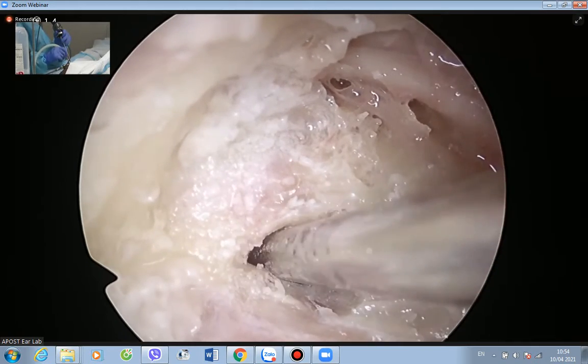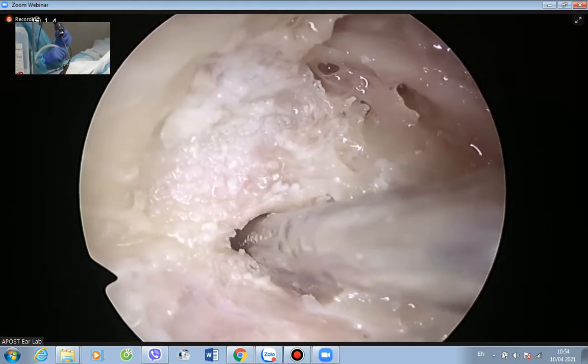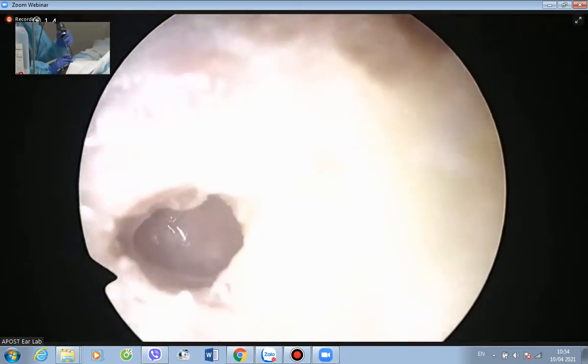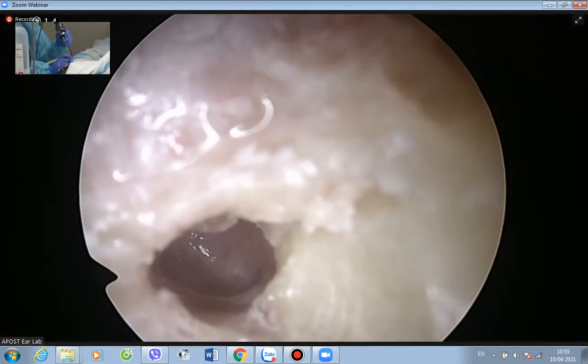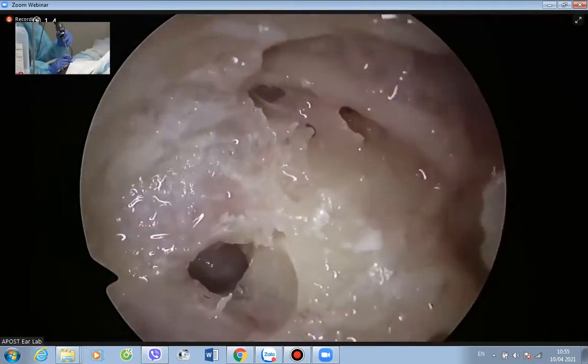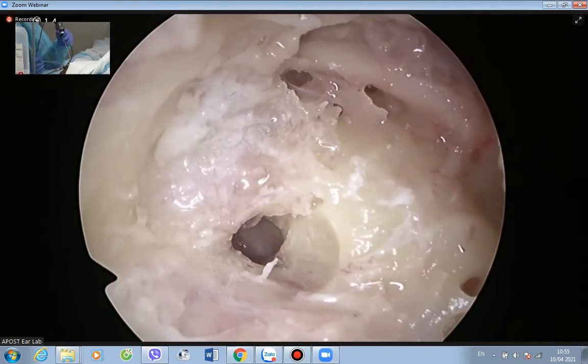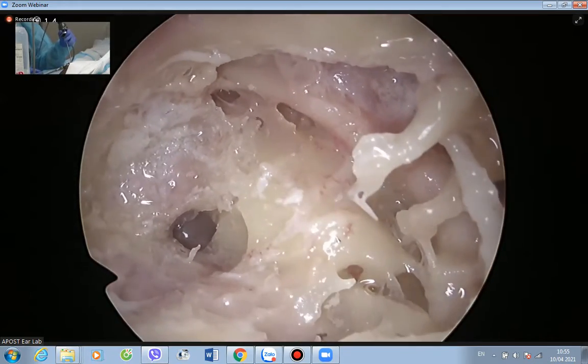So this is the petrous air cell. You can open it a little bit more via this approach. Yeah, see? All right. So this is the petrous air cell that we have drained. So we keep the cochlea intact and keep everything intact. And this is the infracochlear approach.